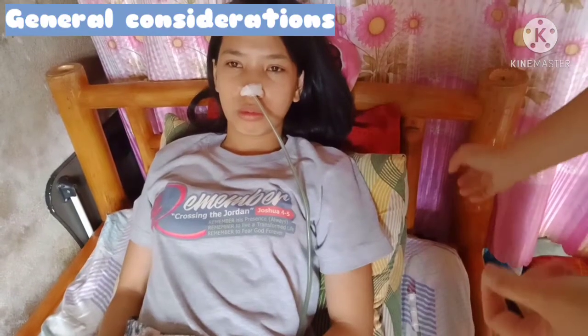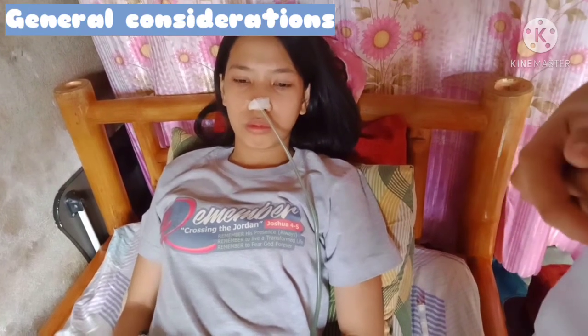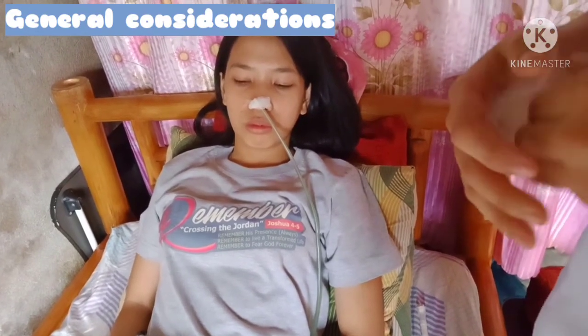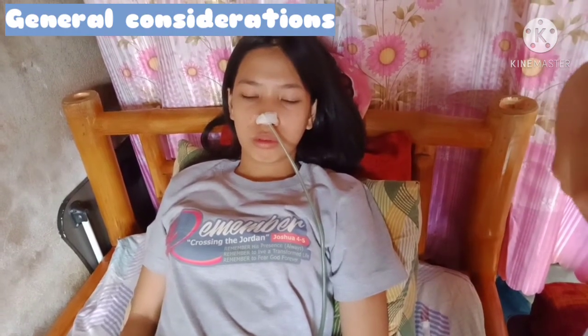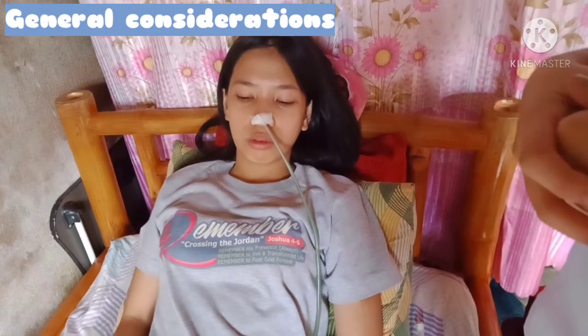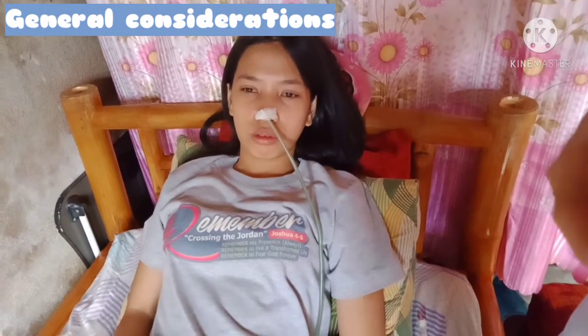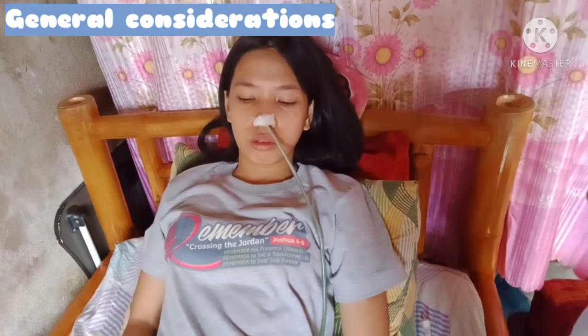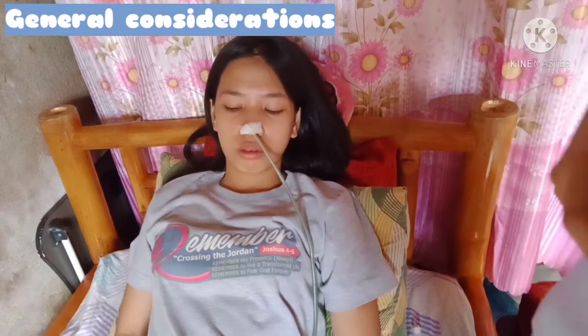So for timing of pH testing, we have to wait at least 1 hour after oral or tube-administered medications. Wait as long as possible after the last feeding, and this is important because formula elevates the pH of gastric contents. For intermittent feeding, test pH immediately prior to administration of a new feeding, usually at least 3 hours after the previous feeding.